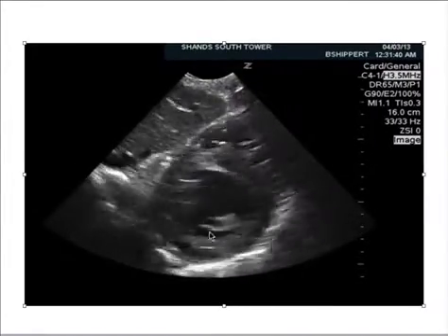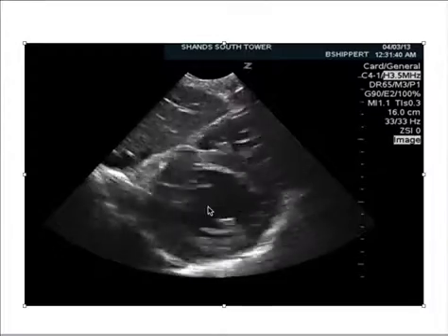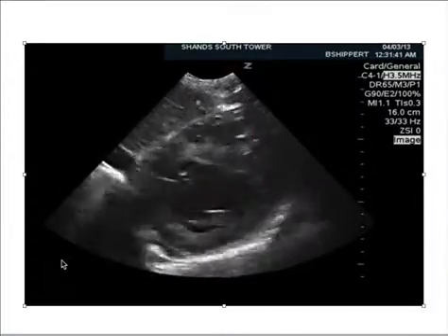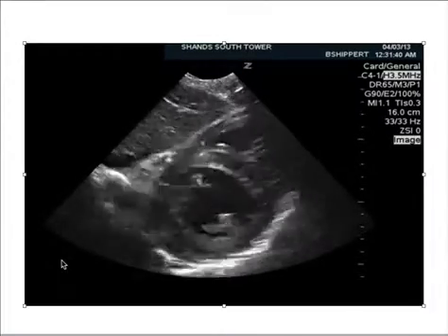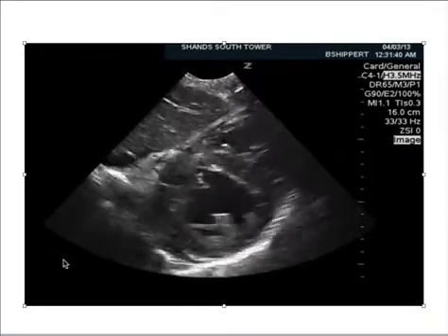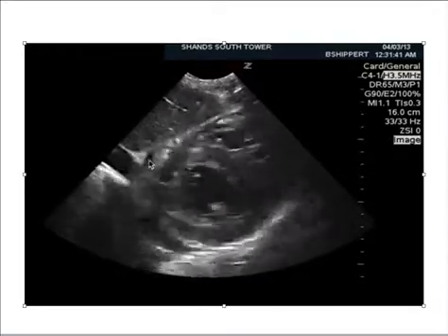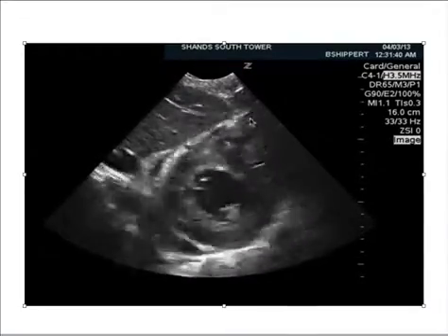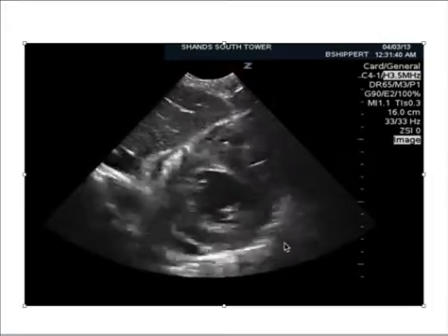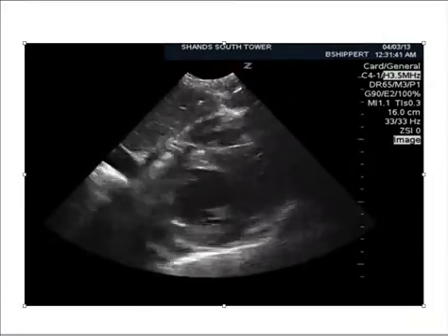Here's a short axis view obtained after the subcostal view, rotated about 90 degrees. It looks like the operator was evaluating function, but you can still see a small pericardial effusion around the heart. It's hard to tell if there's tamponade here because we're not directly looking at the right ventricle.